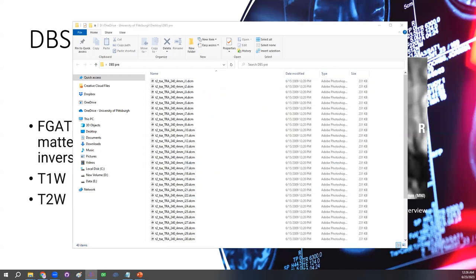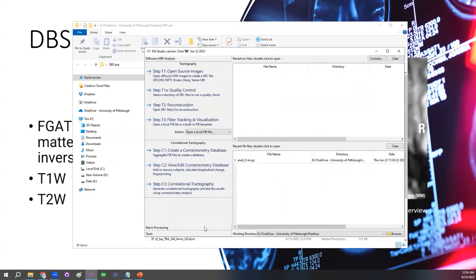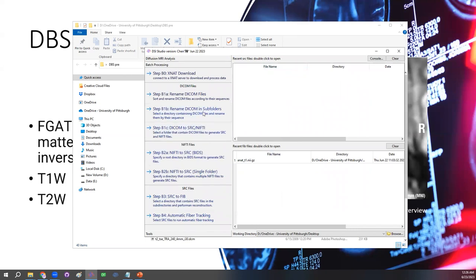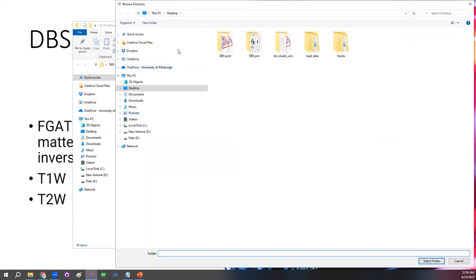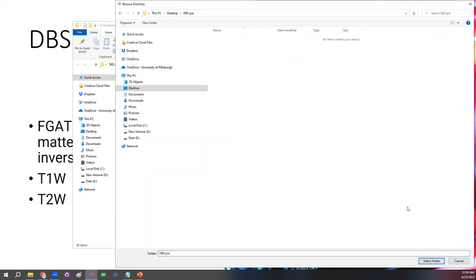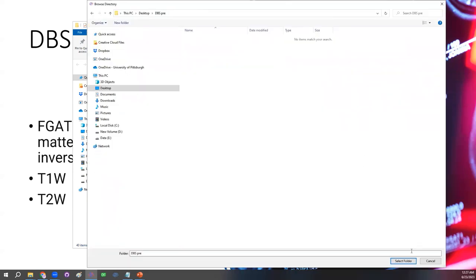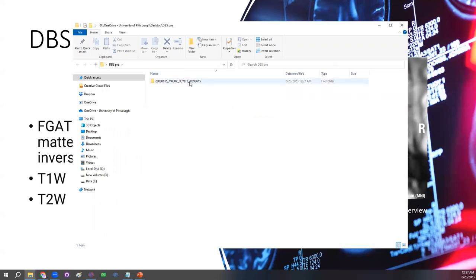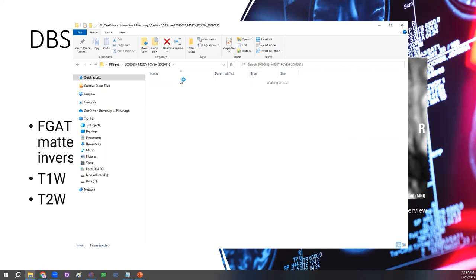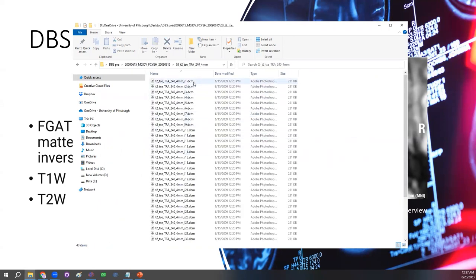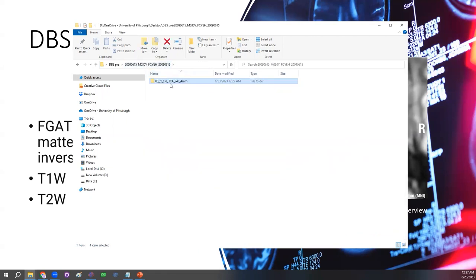The first step is to parse the DICOM file. We start DSS Studio, and the first step is to rename those DICOM files. Select the folder containing all the files — the folder where all the DICOM files are stored. DSS Studio will create a new folder and rename DICOM files according to the sequence. Here there's only one sequence showing up — that's the T2 sequence. If you have multiple sequences, the DICOM files will be sorted according to the different sequences, and the corresponding files will be placed under each folder.